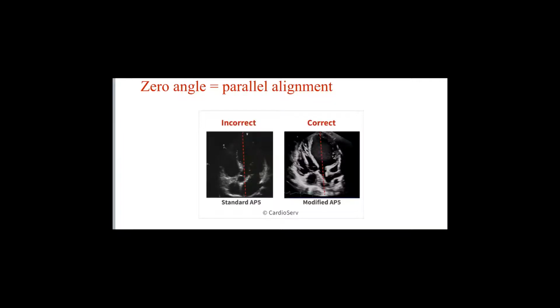And that's why they say probably up to 20 degrees, the underestimation is not so significant and might be acceptable, but after 20 degrees, the difference is a big deal.